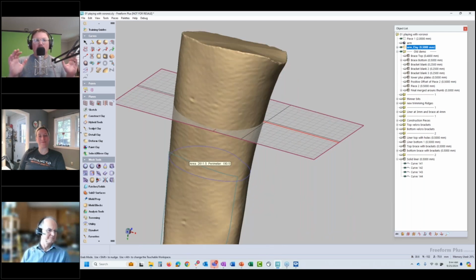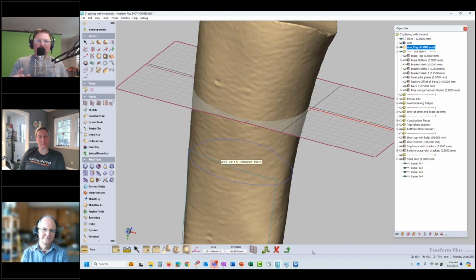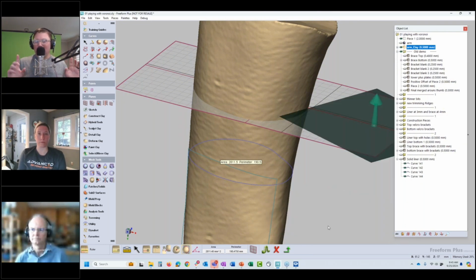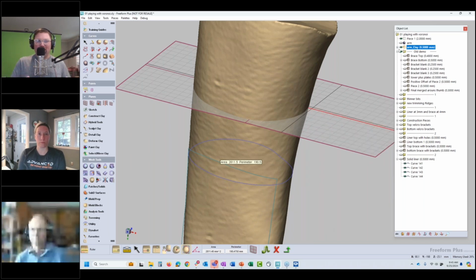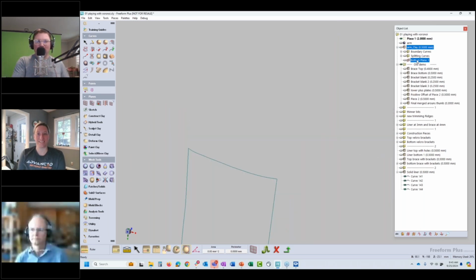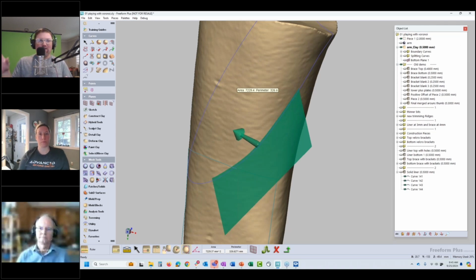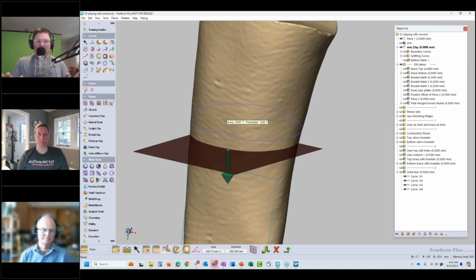But for me, and Katie mentioned radii, I think this is important for people to know: they are doing automation on the front end to capture stuff and are very successful. Now, their sockets may not look like our sockets, but this is the crazy part. Their development is rooted in science. They're training these modules based on the results from prosthetists, based on the results and patient comfort scores and all that stuff. And so they get close every single time, regardless, but that's where it stops for them. They are really good at that part.